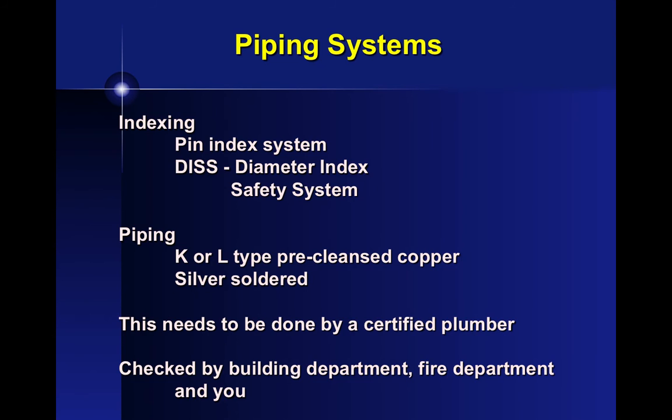So the plumber cut the pipes, brought it to the new office, and soldered it in, but unbeknownst to him, he's now hooked up the nitrous to the oxygen side and the oxygen to the nitrous side. The first patient he saw, he gave 100% oxygen, he gave 50% nitrous oxide oxygen to start an IV. Once the IV was in place, he gave the patient some Versed and fentanyl to put him to sleep to get his third molars out.